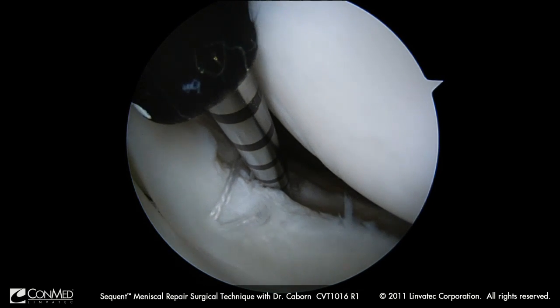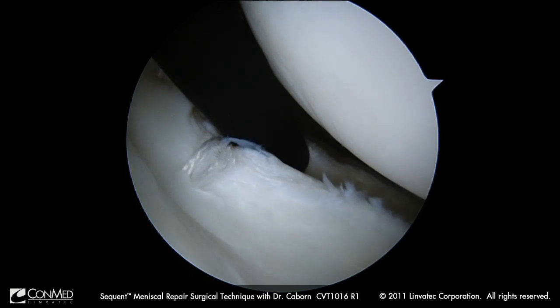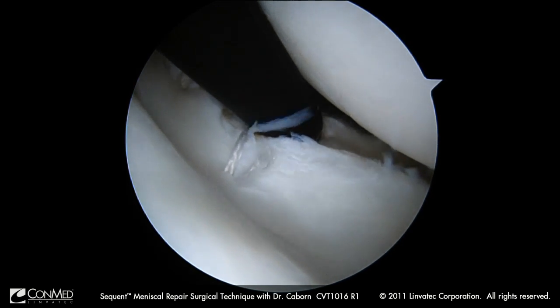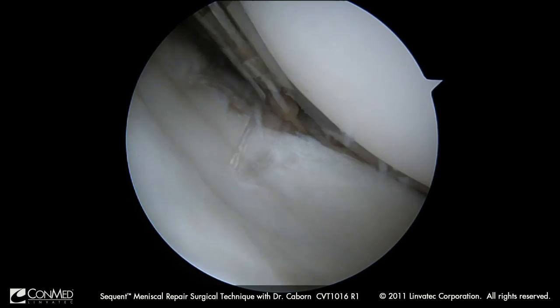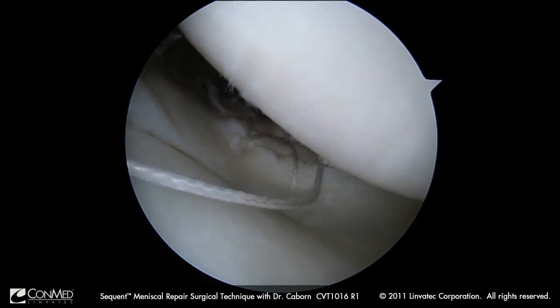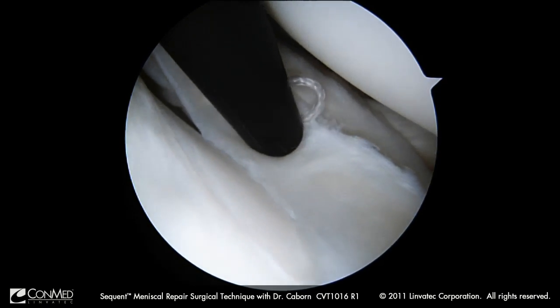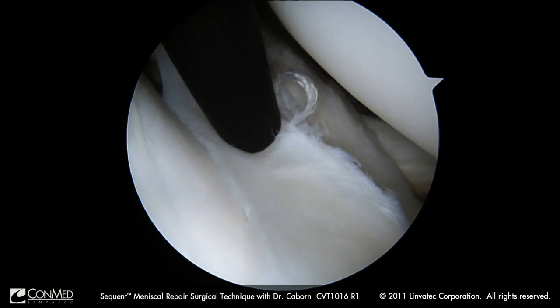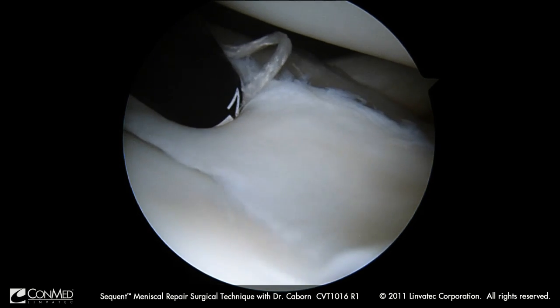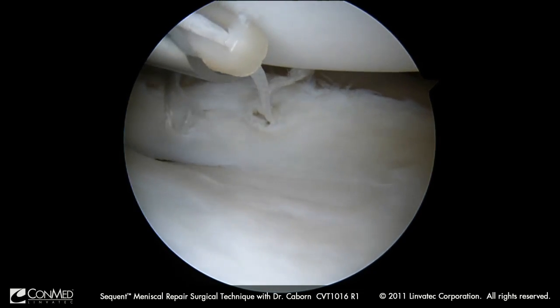In freewheel mode, I want to miss the popliteal tendon, so I go through, pierce. Since we have switched portals, make sure to activate the trigger, fire, and I like this to be facing down as I come out. Remembering I am in freewheel mode, I think about where I am going next — probably about here. I come back, give myself a little slack, then go in, penetrate, rotate two revolutions to lock my cleating system, activate my trigger, and fire my implant. Coming back, and you can see my suture in position.